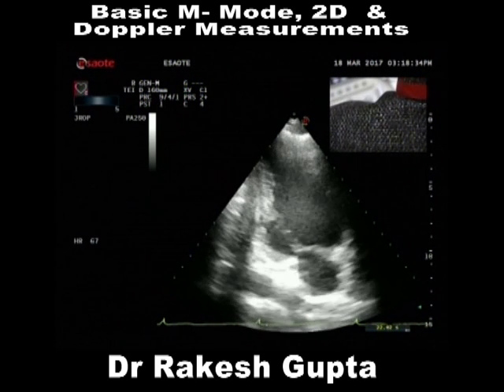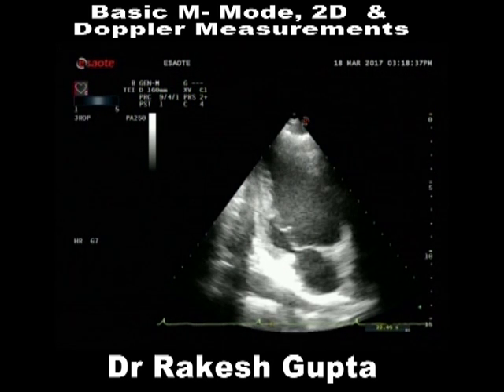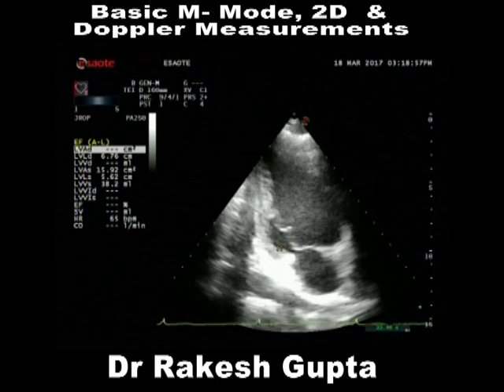Now is the difficult thing. Most important thing is this is a true 2-chamber view. Here are the papillary muscles, inferior wall, these are chords and this is the mitral valve. So I am going to trace the same thing during diastole and systole. Not a very good imaging quality, and I am going to now presume many things. Apex I can't see.